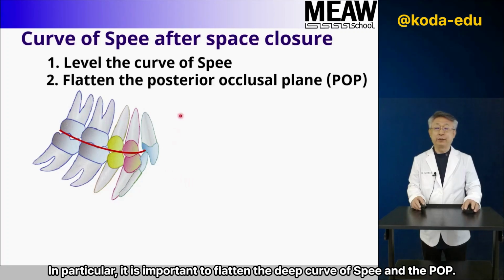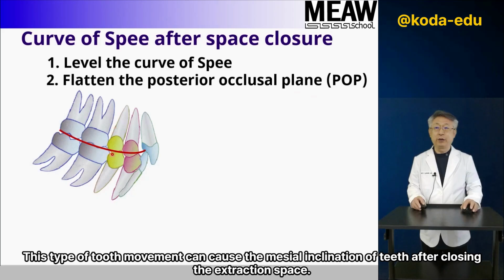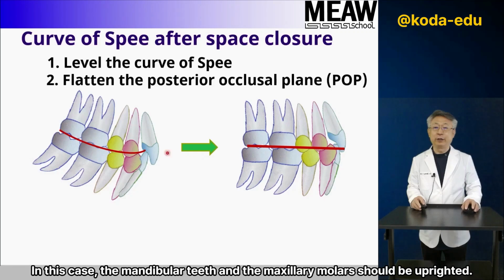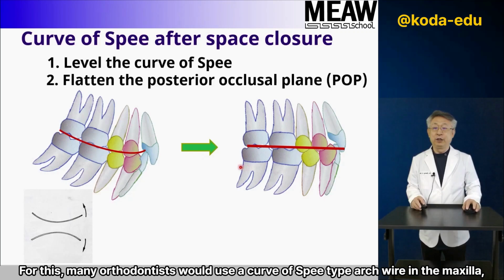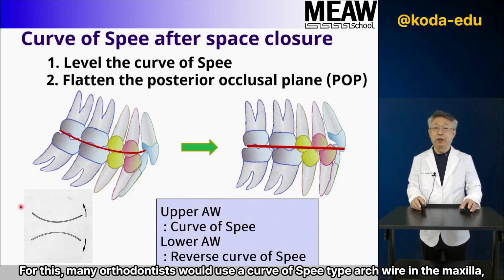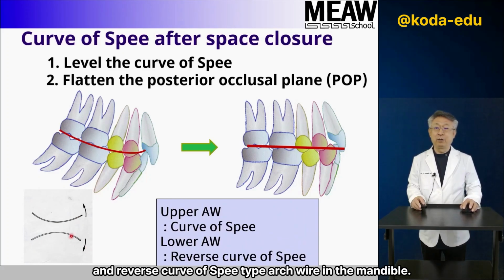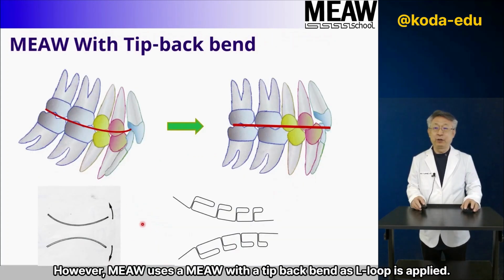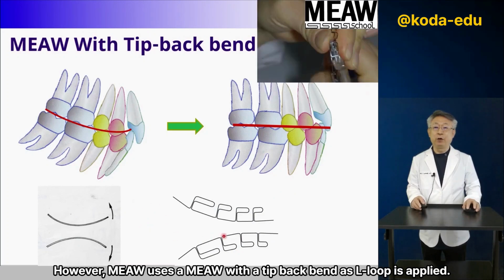In particular, it is important to flatten the deep curve of Spee and the POP. This type of tooth movement can cause the mesial inclination of teeth after closing the extraction space. In this case, the mandibular teeth and the maxillary molars should be uprighted. For this, many orthodontists would use a curve of Spee type arch wire in the maxilla and a reverse curve of Spee type arch wire in the mandible. Ready-made wire also can be used. However, MEAW uses a tip back bend as a loop is applied.